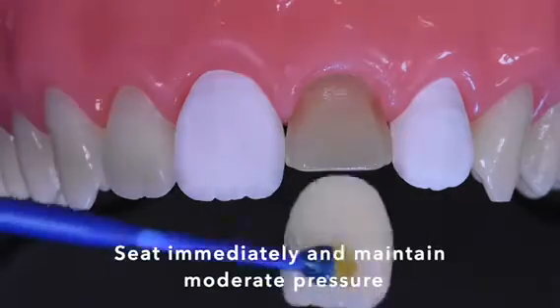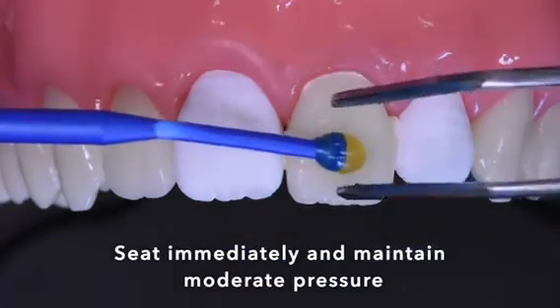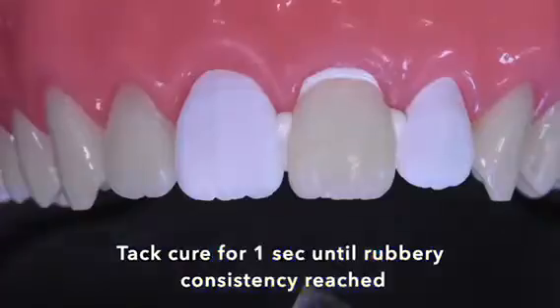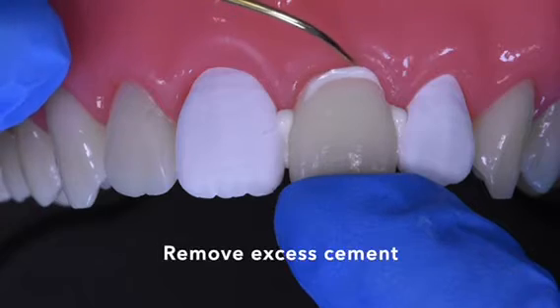Seat the veneer immediately into position and try to maintain moderate pressure throughout this process. Tack cure for 1 second. Remove excess cement with a hand instrument and dental floss.